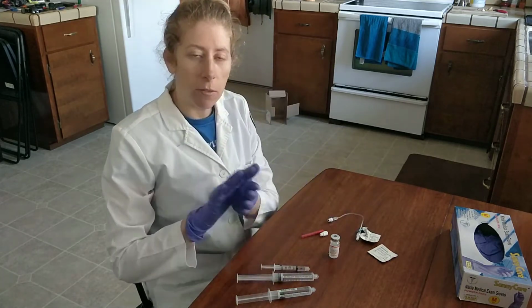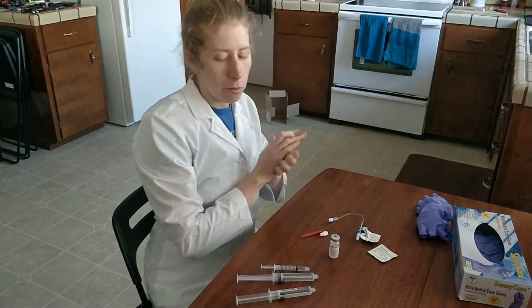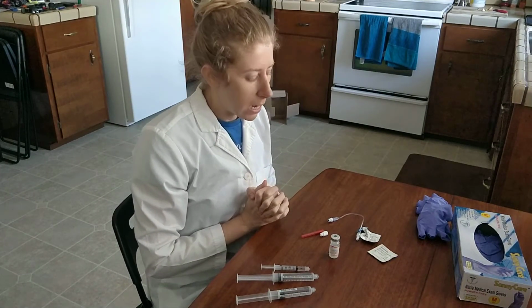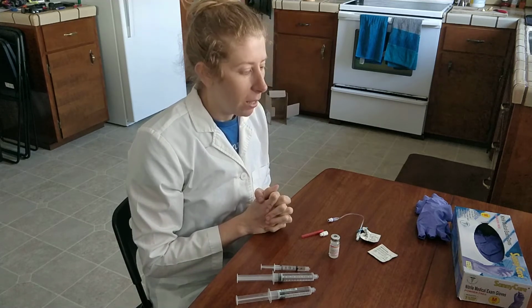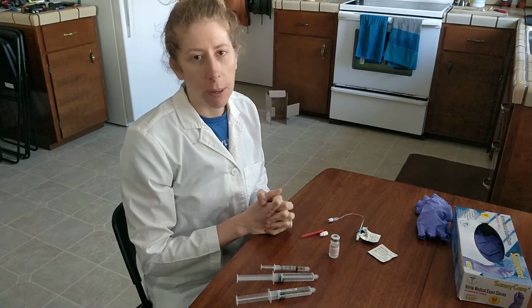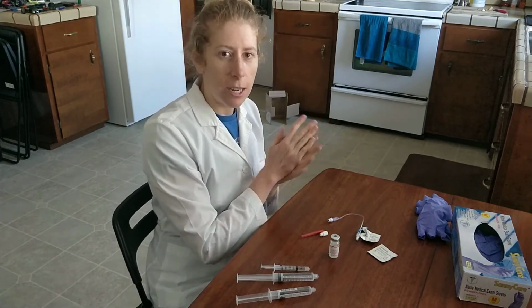Then I will dispose of all of my sharps in the sharps container. I'll remove my gloves, perform hand hygiene. I'll take the patient's vitals again as indicated. I will reassess their IV site to make sure that there's no infusion reaction. Then I will perform the final 4, including making sure the patient is safe and comfortable, that they have their call light, ask if I can do anything else for them. I'll perform hand hygiene again.